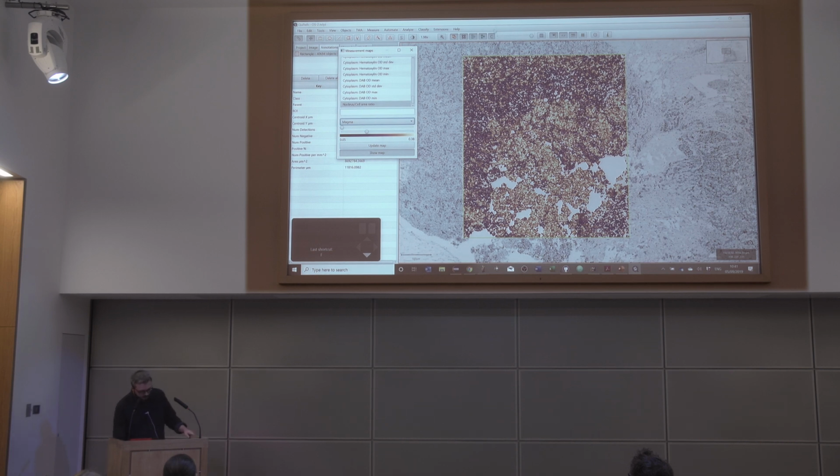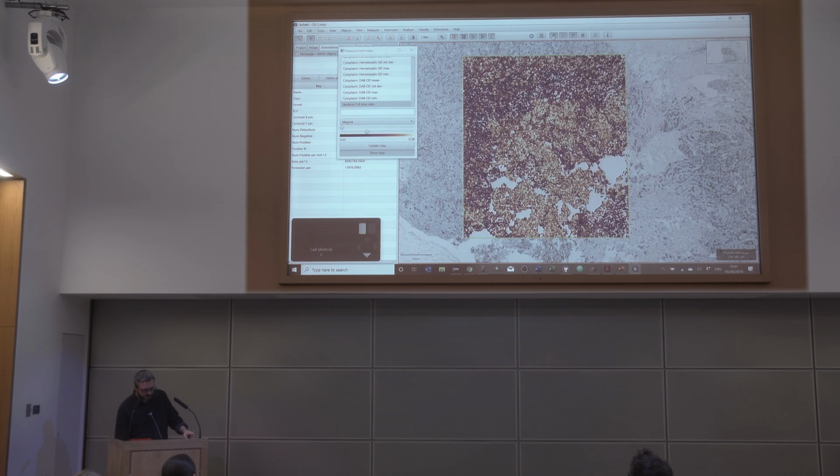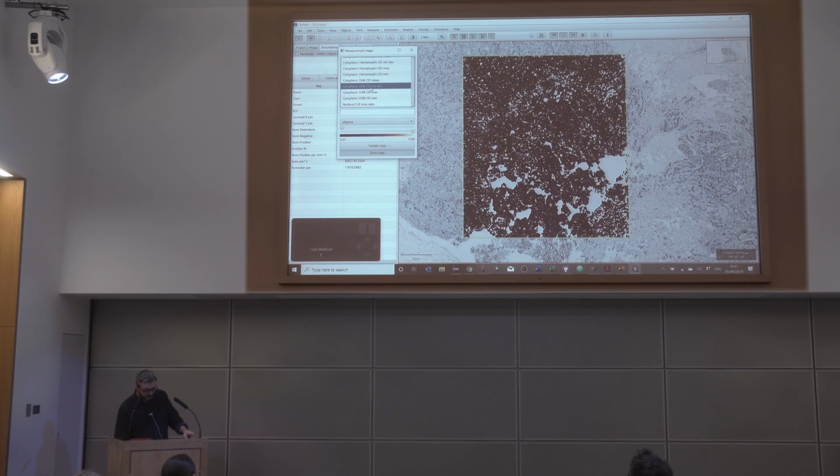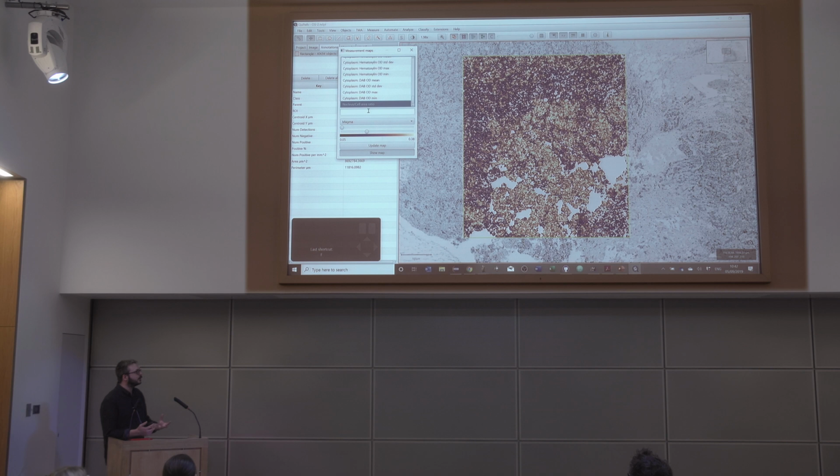And so you can see that these denser areas, which I'm not the one qualified to say, but I'm going to say tumor cells here, do end up with higher values, as you can see through the heat map, for the nucleus to cell area ratio. With some of the others, there may be some kind of connection, but it's a little bit less distinct. But in itself, that's probably not going to be enough to distinguish between different cell types.